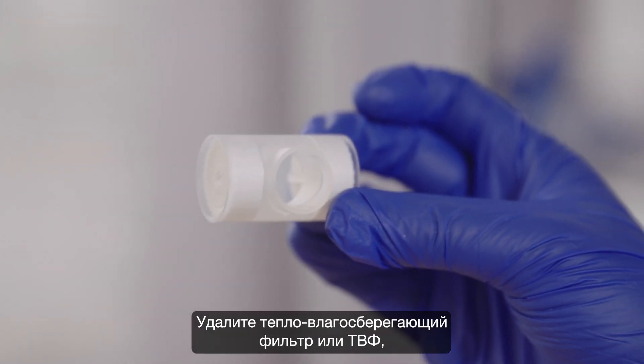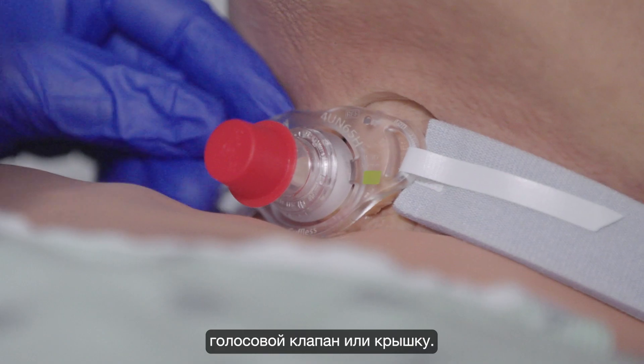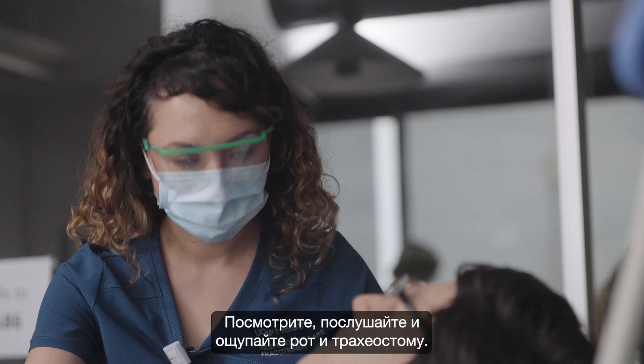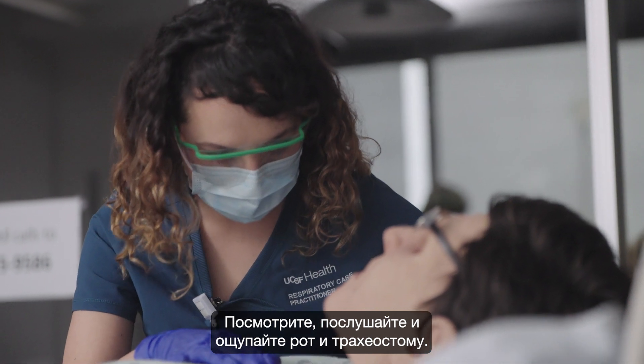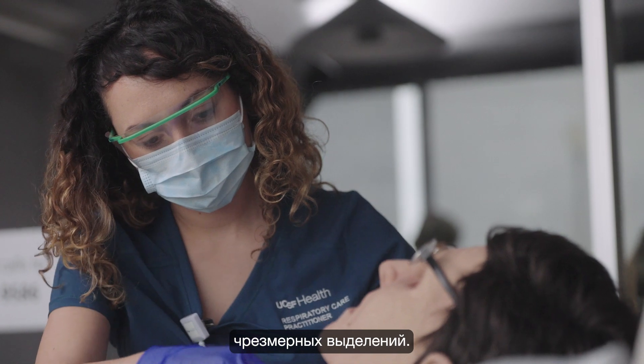Remove any heat-moisture exchanger, or HME, speaking valve, or cap. Look, listen, and feel at the mouth and tracheostomy to check for any blockages in the tube or excessive secretions.